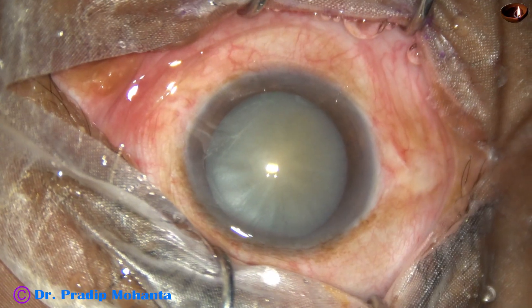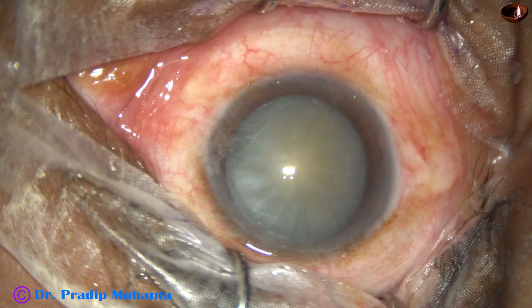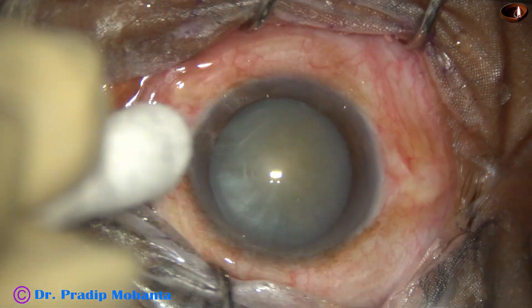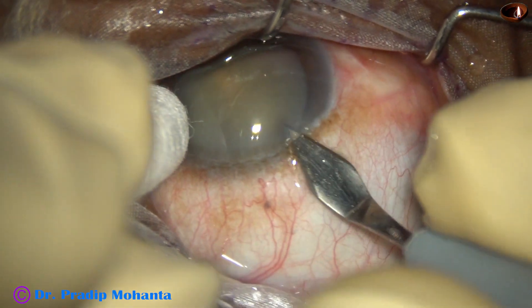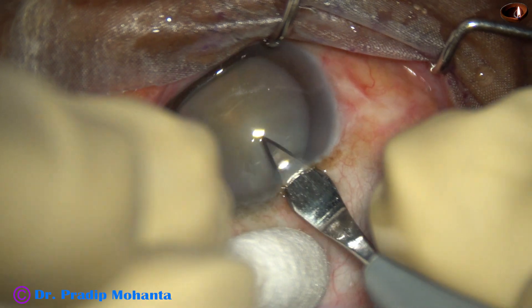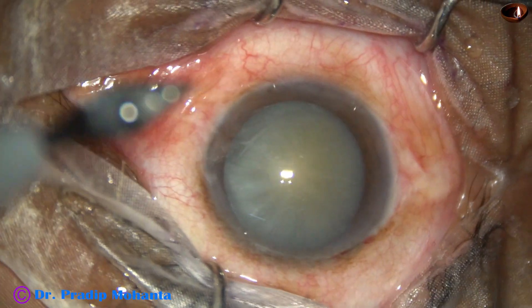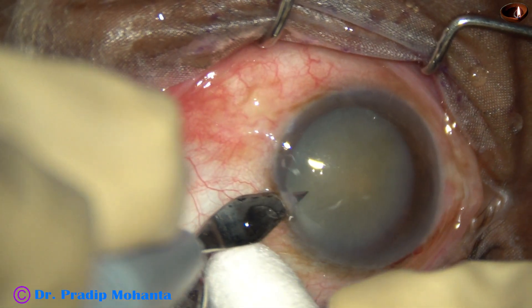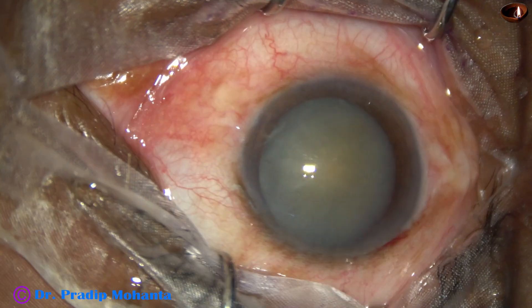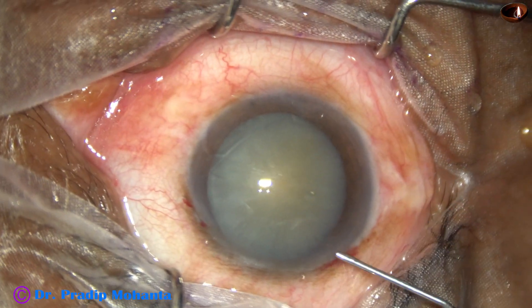This is a totally unedited real-time surgery. After thorough cleaning of the ocular surface, the main incision is placed in this case at around 11 o'clock. We can see that this is a white cataract. The cataract is not very hard — nuclear sclerosis grade 3 or so. This is a side port on the left side of the main incision, about 3 o'clock hours away.